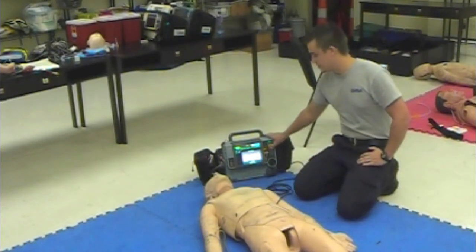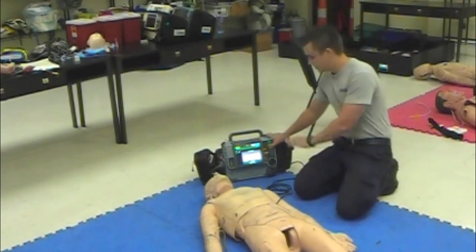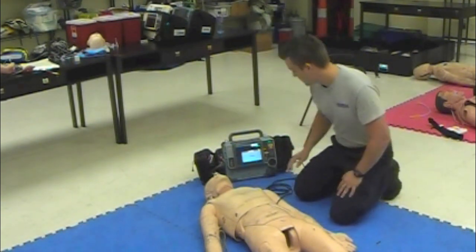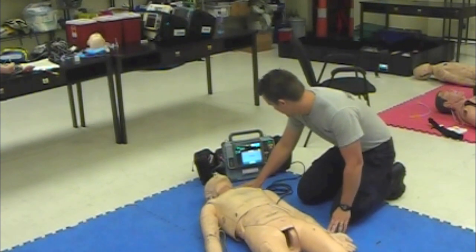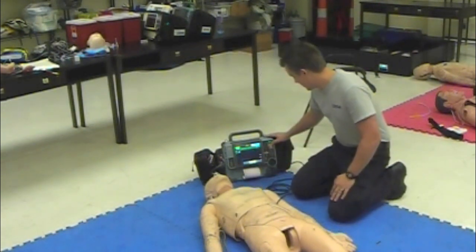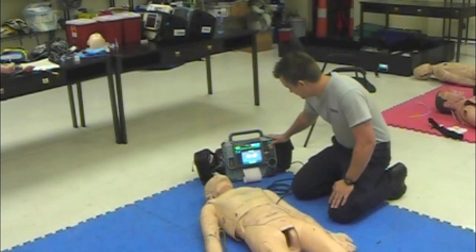All right, we're going to shock on 3. Ready? Clear the patient. Ready? 1, 2, and 3. Shock delivered. All right. So I still see VTAC. Do I have a pulse with this? Yes. Okay. So I'm going to go ahead and shock again at 200.